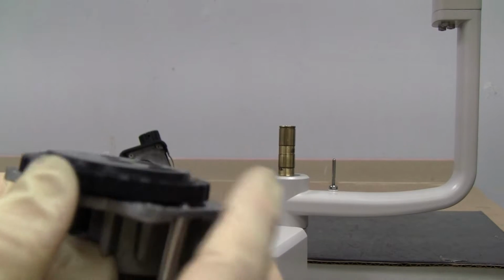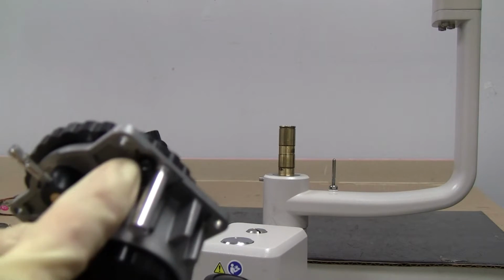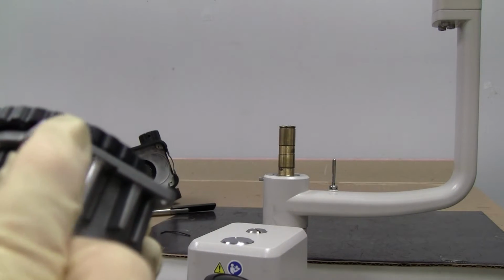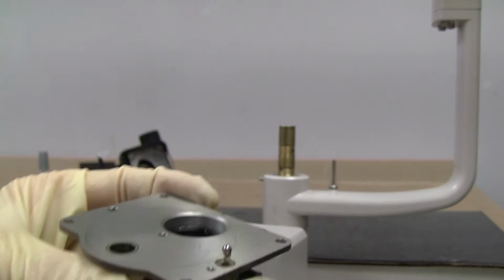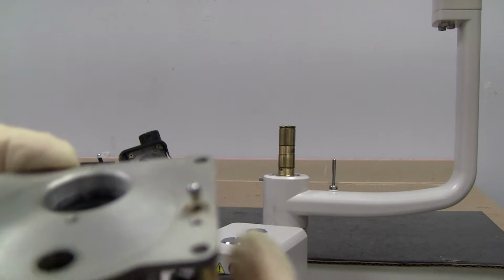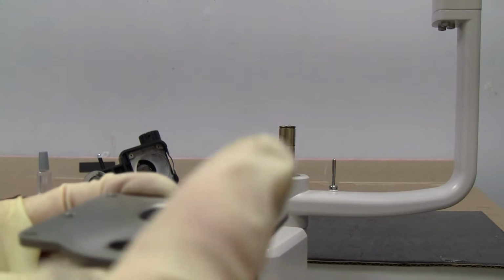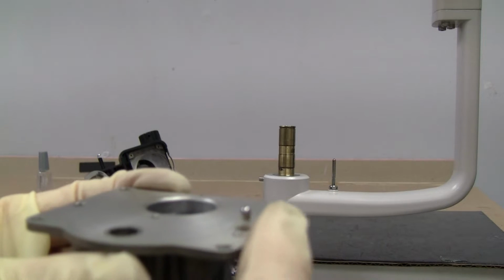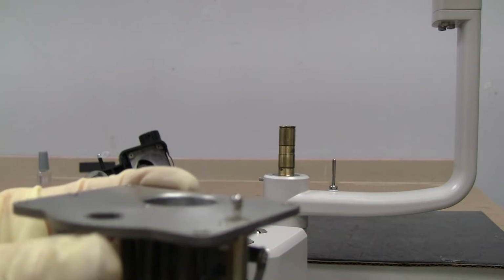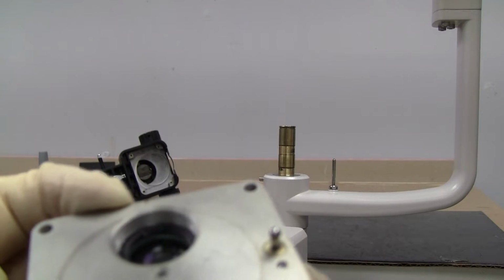But this is the diaphragm wheel, and it's got a detent with this, and it has a screw under it so it can turn, and this is a little cam so it can go one way or the other. This is a little cam, and it can turn one way or the other, and that adjusts your diaphragm wheel when that needs adjusting. You can see it. It's a cam.